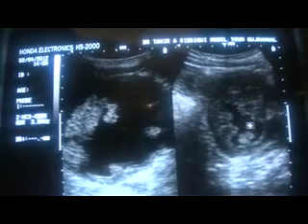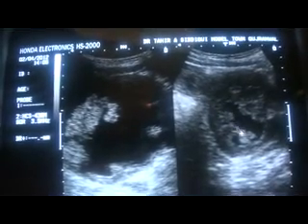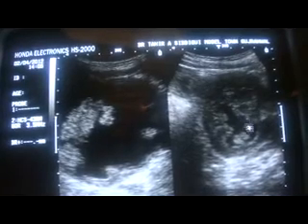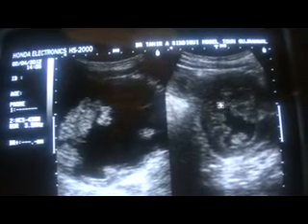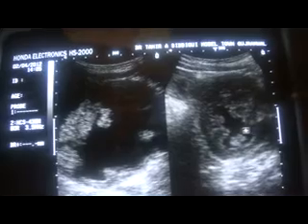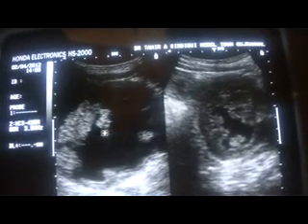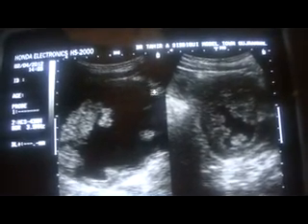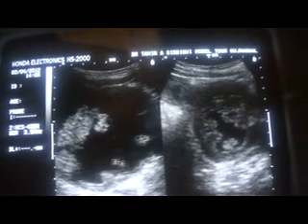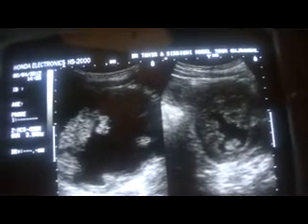He is evacuating the bladder completely, and unfortunately though he is having a lot of focal areas of echogenicity within the urinary bladder. I do pray for a benign cause to come out, though my sixth sense is saying that these are transitional cell carcinomas, as he has remained a heavy smoker throughout.